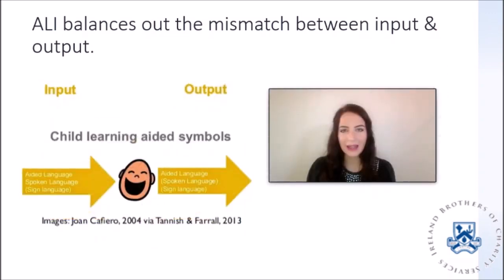By using ALI, communication partners send the message that using picture symbols is an acceptable means of communication. They teach the language learner the meaning of new words, but also how to access words. Even AAC users who have good language skills and seem to understand most words and concepts still need a demonstration of where these words and concepts are so that they can access them to communicate.